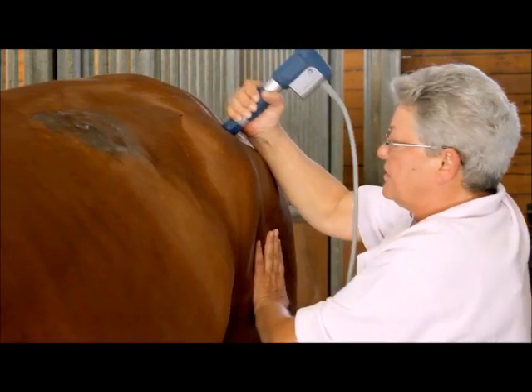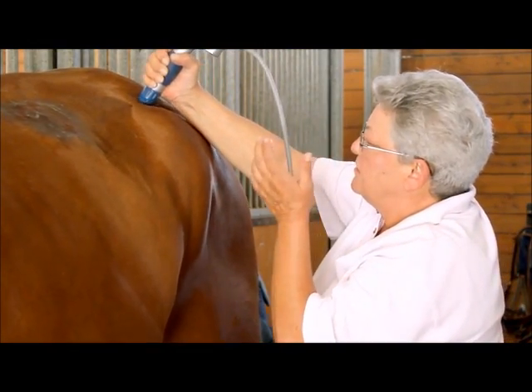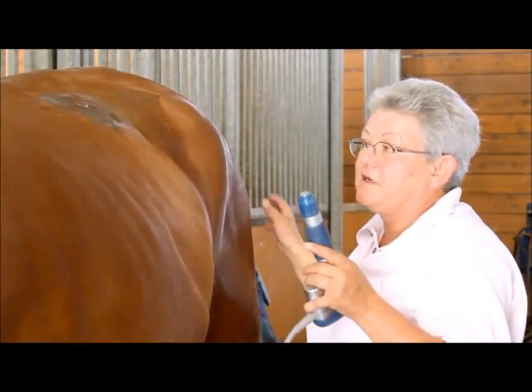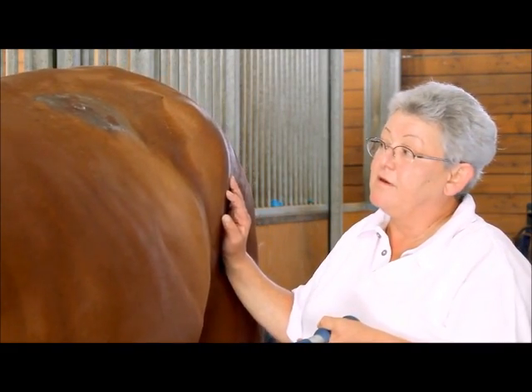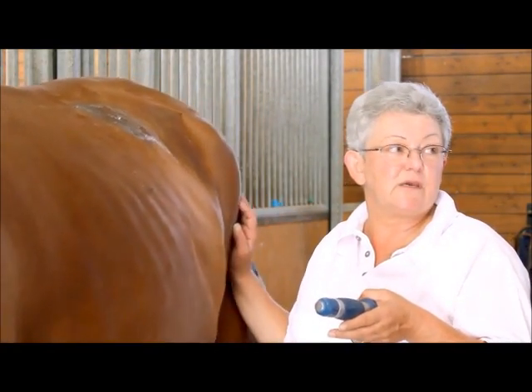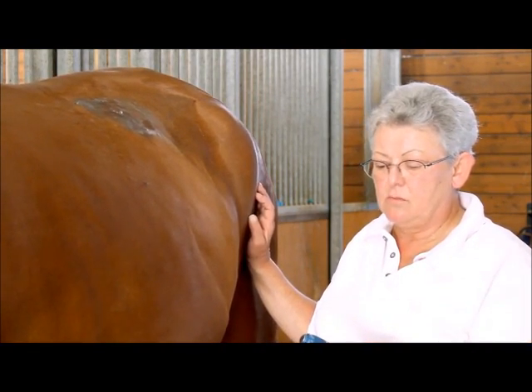So Chris, let's talk about the cost. How often do you make a revision — once a year or twice a year? Depending on the horse's problem. If I have sport horses in training with no bigger problems, I do it about once per month. With horses who have a direct problem, I do a series of four to six treatments every week. And revision costs — how often do you change the revision? Every half a year, about. Depends on how much I use it — sometimes after three months, sometimes after half a year.